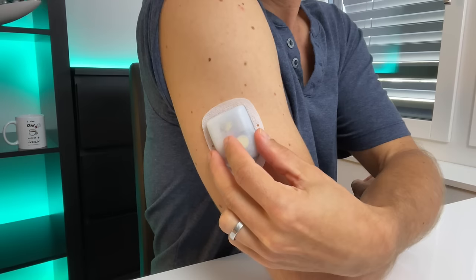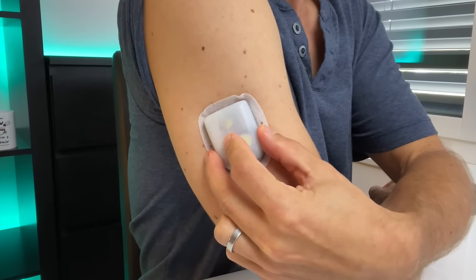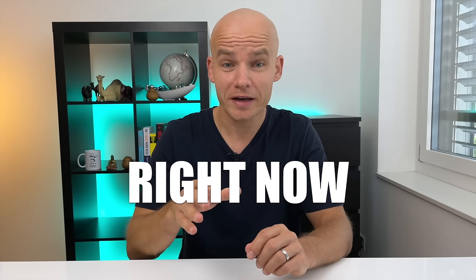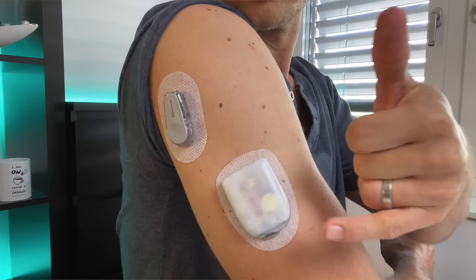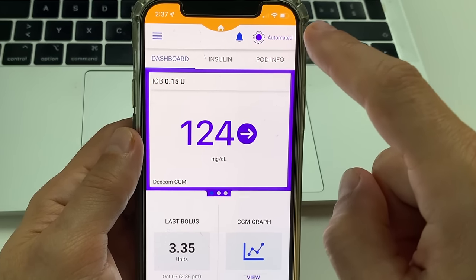This is Omnipod 5, a brand new version of this tubeless insulin pump. You can start using it right now or really soon, depending on which country you are in. In this video I will go through the key features of Omnipod 5, what's new, what makes Omnipod 5 so unique, when exactly you can get it and how it feels using it in real life. Let's go!